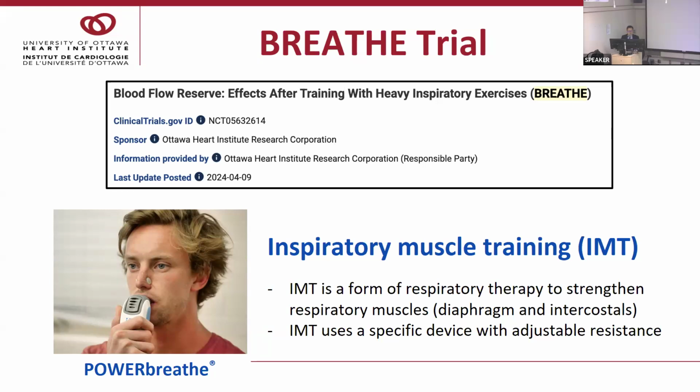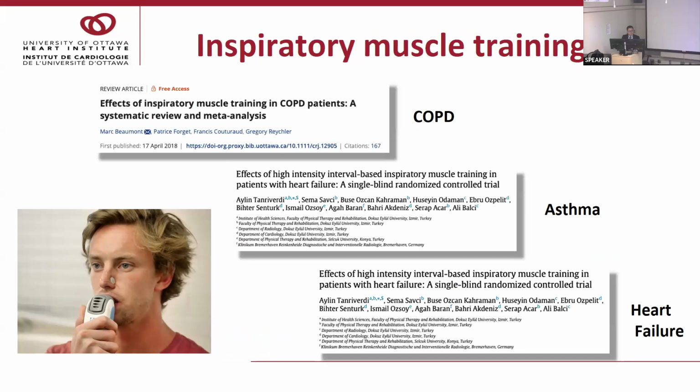This training uses a specific training device, which is called Power Breathe. This training is primarily used for patients with lung diseases such as asthma or COPD, as well as post-surgical patients. However, it is also known to be beneficial for patients with heart failure.